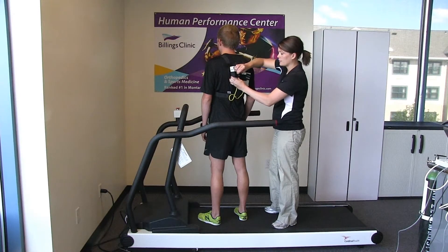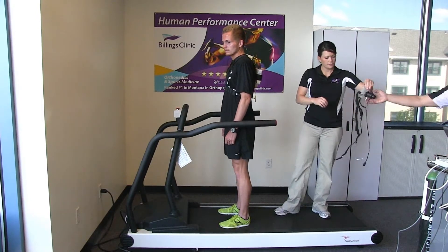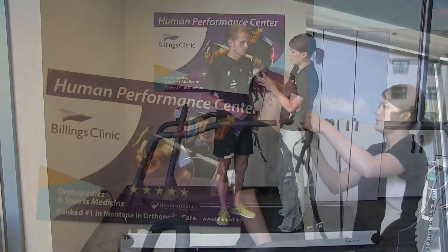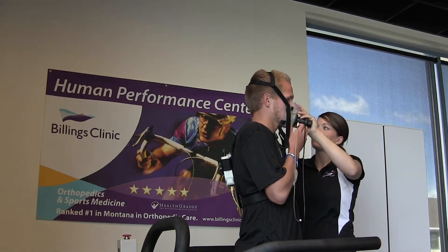A VO2max test involves hooking you up to a harness with a mask on. We determine what protocol to put you on according to your training and your goals. You're on the treadmill if you're a runner for about 10 to 15 minutes, and if you're a biker, the same amount of time.